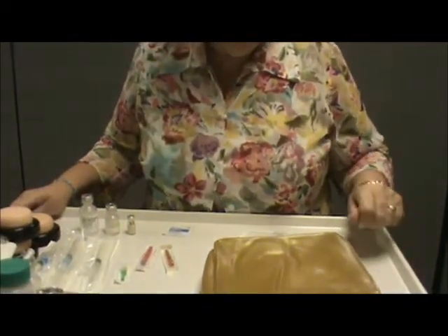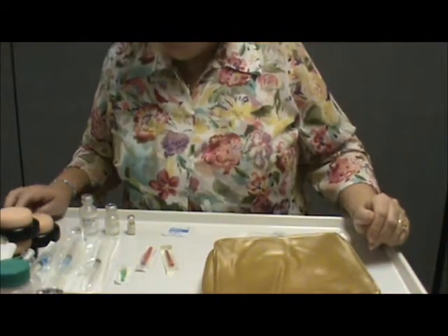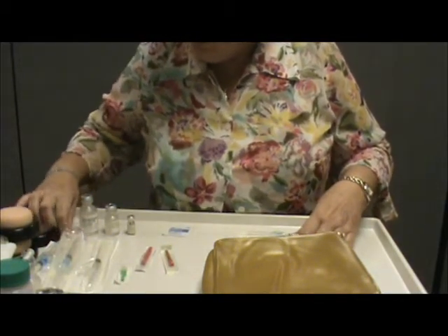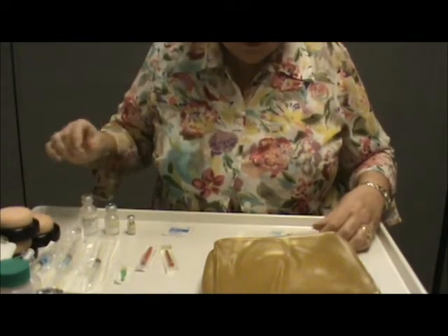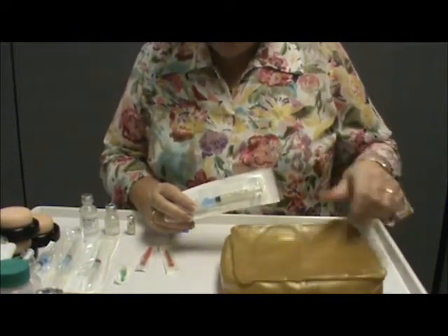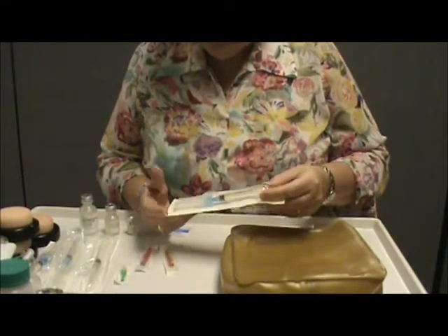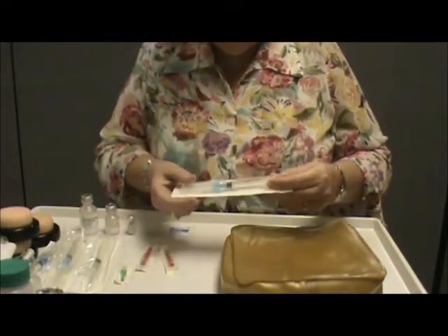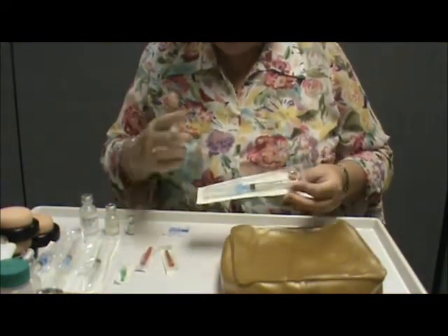Okay, we're going to do a practice on IM injections using vials, and also we'll practice with ampules. When you obtain your syringe, generally now you're going to have some type of a safety needle. Sometimes your syringe will come with a needle attached. Other times it'll come with just the syringe in a package alone, and then you have to obtain your own needle.